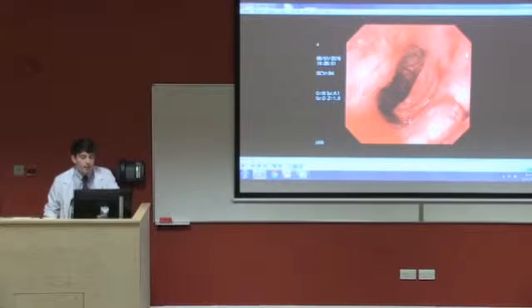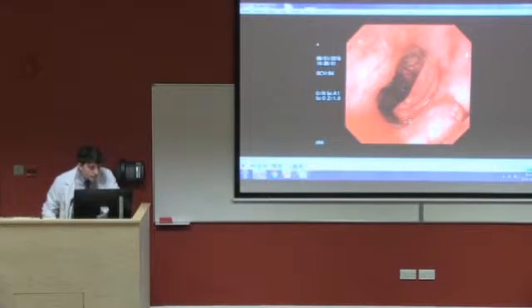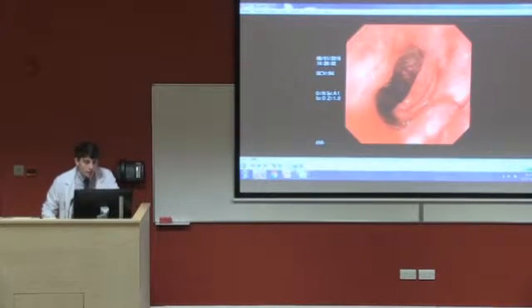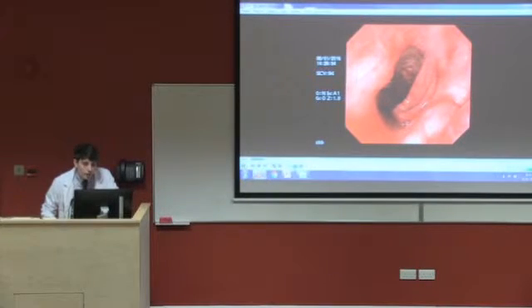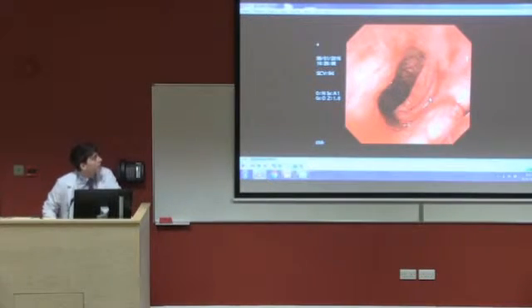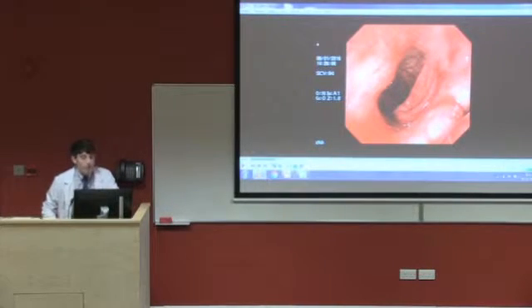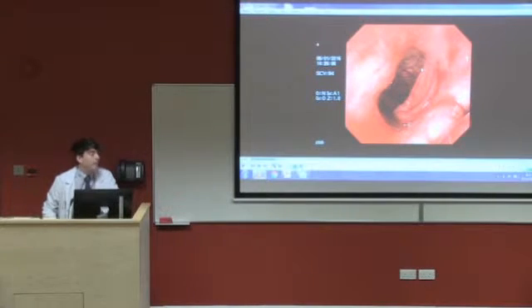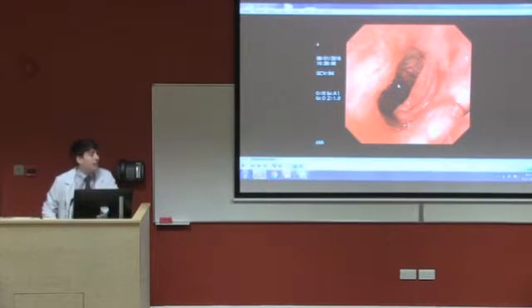Closest to the camera we can see the rectum, and as we move forward you can see more of the colon. As we approach here now, on the right-hand side you can see the correct lumen which is continuous with the rest of the bowel, and then to the left we can see where the anastomotic dehiscence has occurred, and beyond that leads into the leak cavity itself.